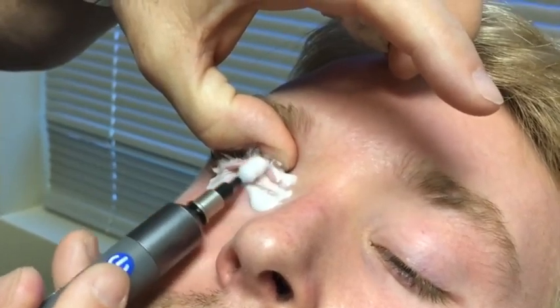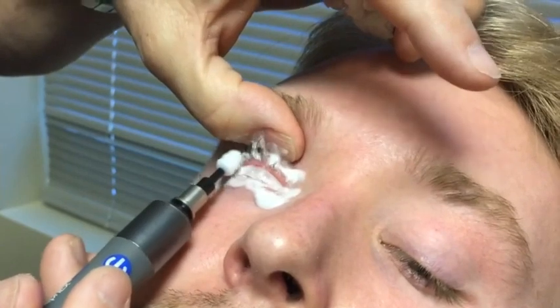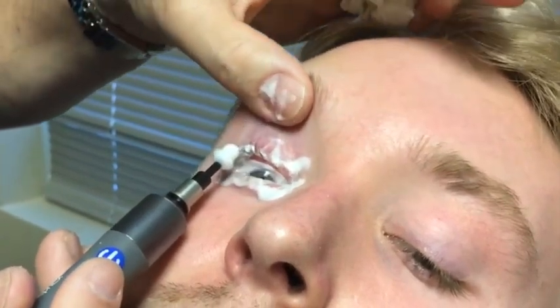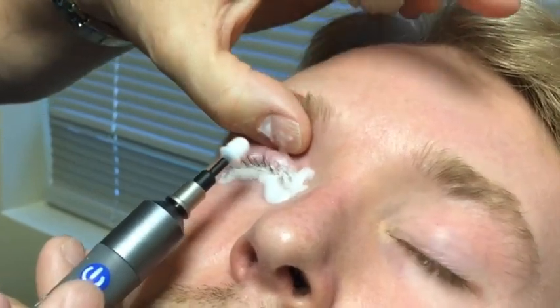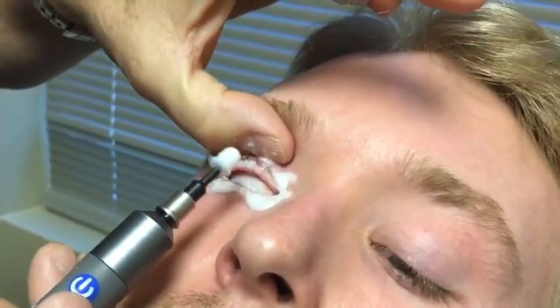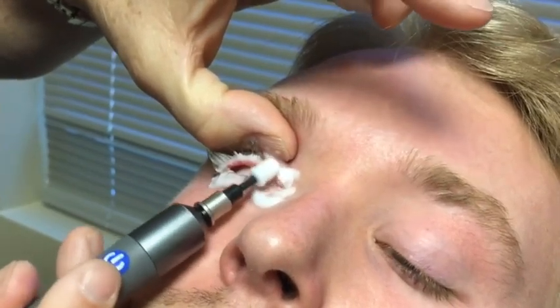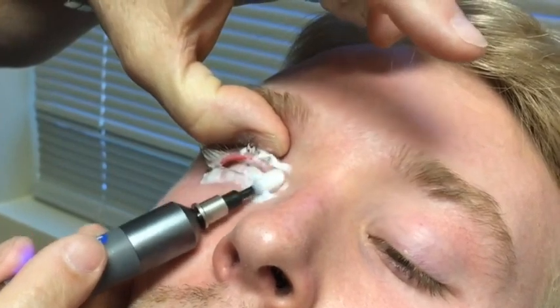And a very common mistake is, you'll get great exposure like this. You'll start treating, and then your thumb will forget what it's doing over here. And next thing you know, all you're doing is treating lashes. So you got to do both things at once. 2 steps here: step 1, roll and push in; step 2, maintain that while you treat. Now we're going to push the button again, reverse the spin.